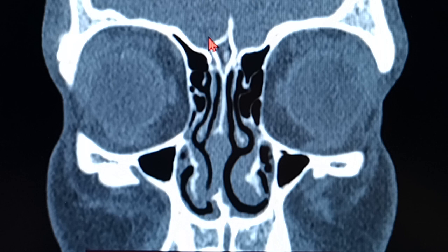If it is too long, this is the most dangerous situation, where you can actually injure the skull base at the lateral lamella. If it's medial and if it's too small, or you can say the vertical height is too small, that's the safest condition where we can go for the surgery, where injury is not that common. So that is basically the rough estimate.